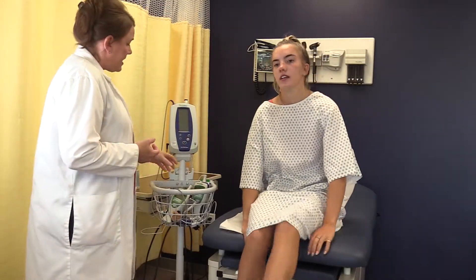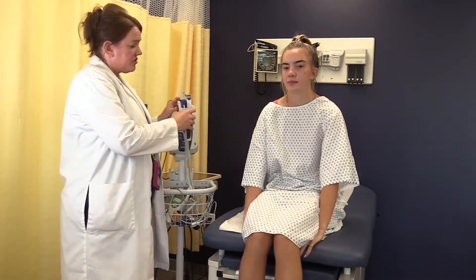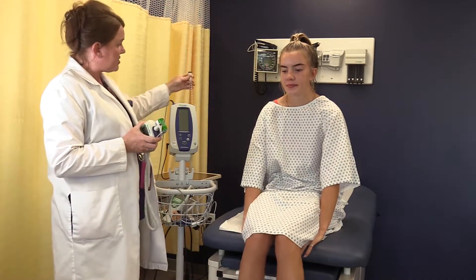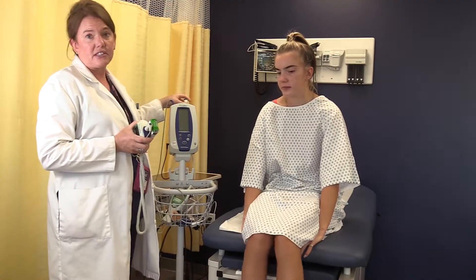When gathering a temperature on a patient, there are multiple routes that you can use. The oral route is going to be the most common that you'll see. The key is to make sure you're using the correct probe — blue indicates oral. We'll talk about the different colors for the different routes in a moment.